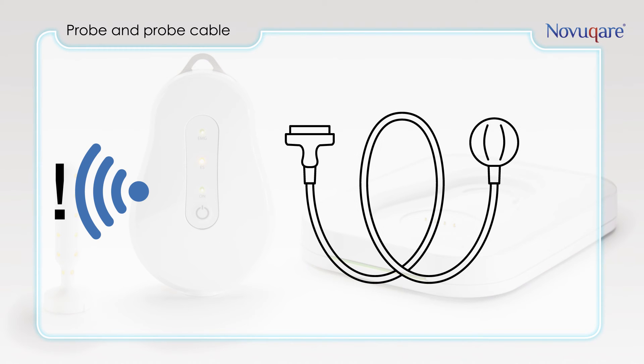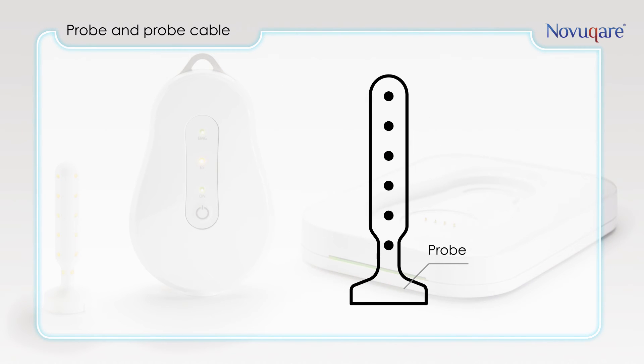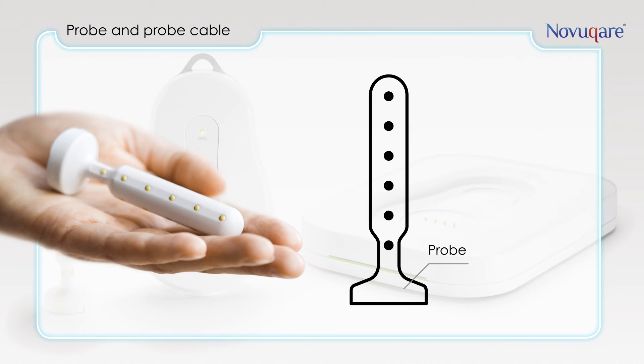This is the probe cable. With this cable you connect the handheld to the probe. The probe has 24 anti-allergic gold-plated electrodes and is suitable for both rectal and vaginal use. The probe is personal and can be used by one patient only to prevent cross contamination and infections between patients.